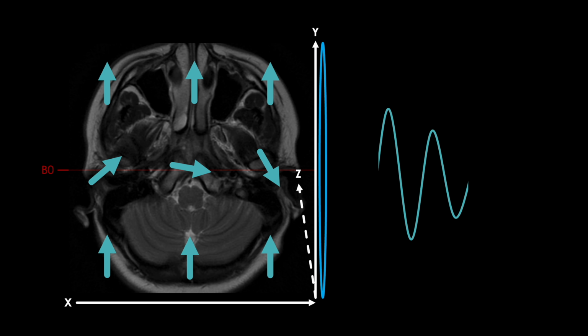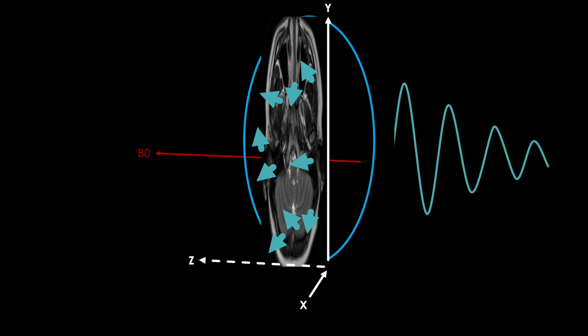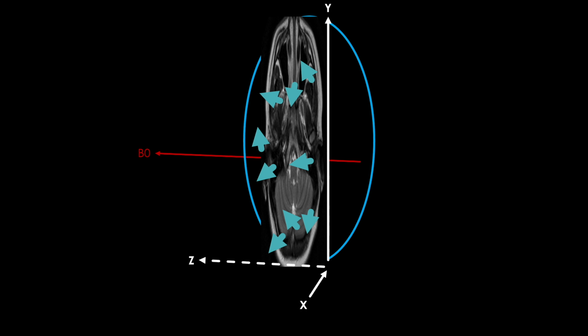If we look at this now from the side, we also see these magnetizations have ever so slightly started relaxing back towards B0. If we continue to follow these magnets as they spin, we'd see something like this. They get more and more out of sync and dephase, subsequently decreasing our recorded signal until eventually it's lost. And that's what brings us to what we know so far, which corresponds to this time point on our pulse diagram. Let's not worry about the gradients right now.